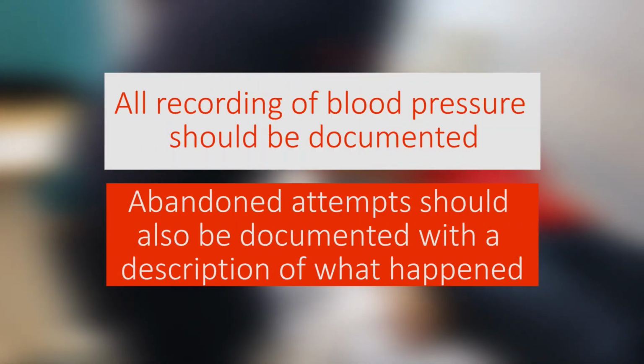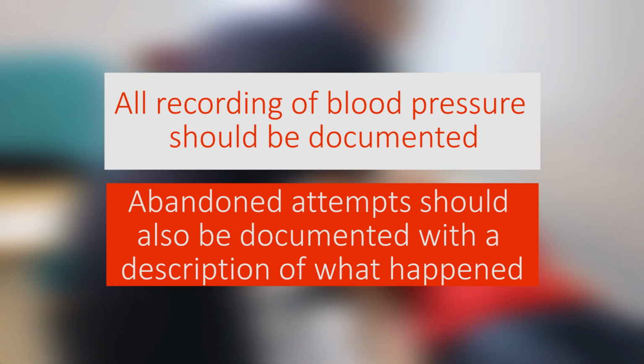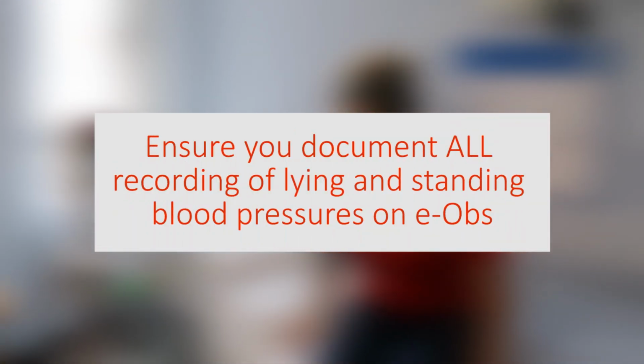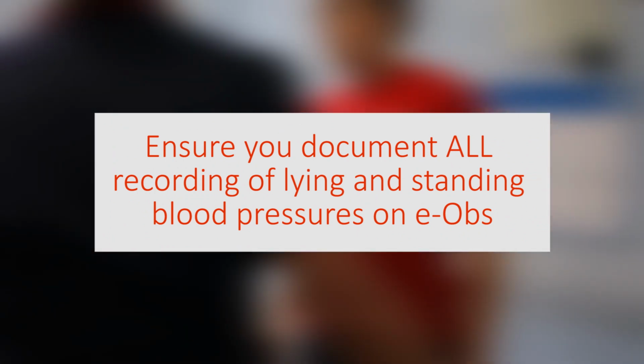All recordings of blood pressure should be documented. Abandoned attempts should also be documented with a description of what happened. Ensure you document all recordings of lying and standing blood pressure on EOBS.